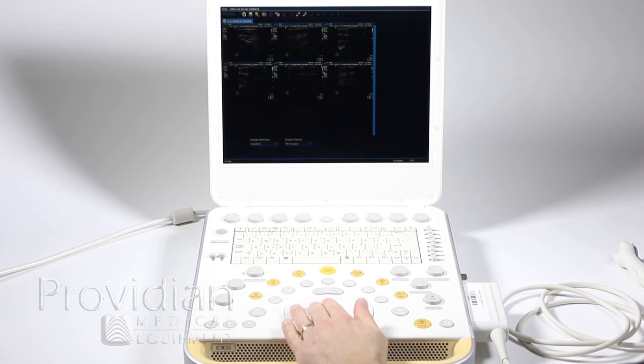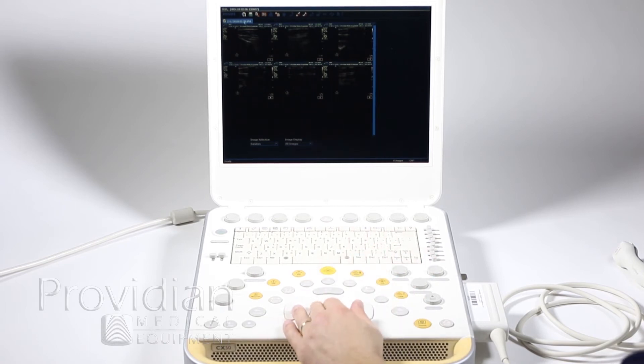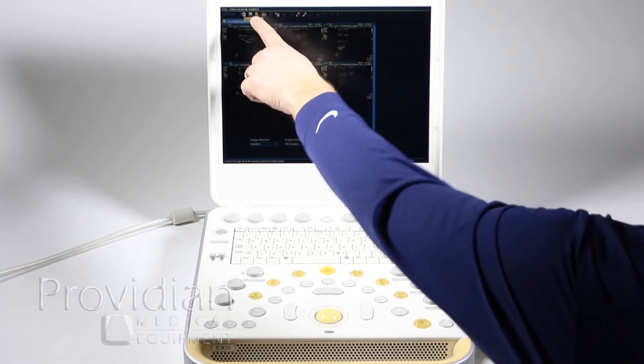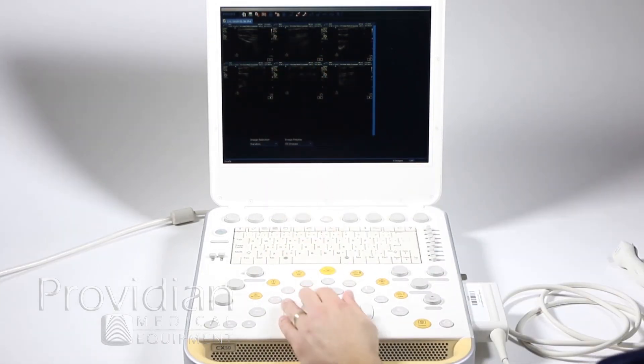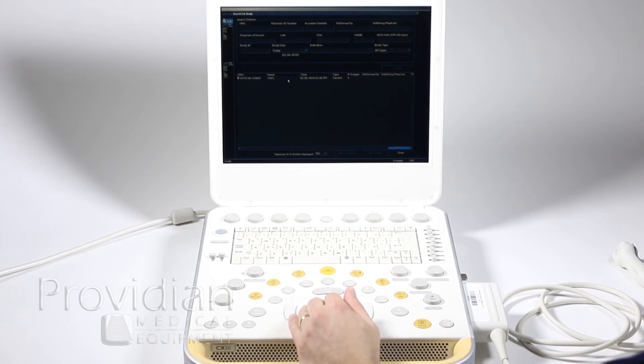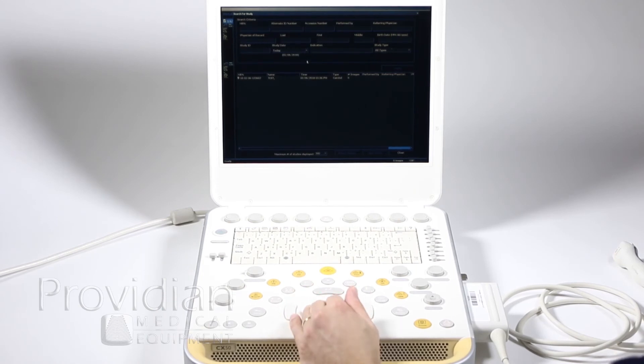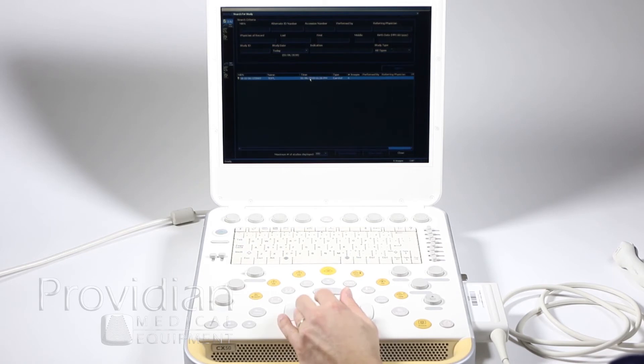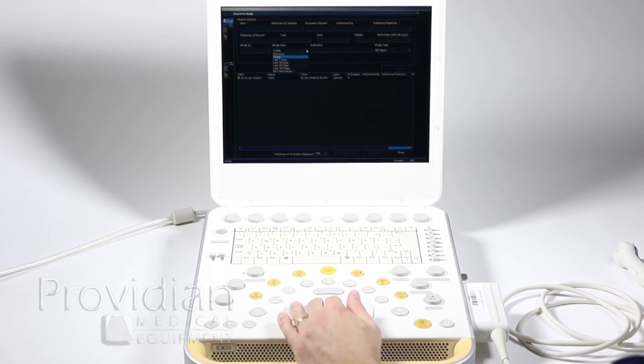So I'm going to go back to that archive screen. Let's say I don't want to see the current patient, you want to see a previous patient. Come up here and search for study, and see I've got this just to study date for today, so it's only showing this right here.